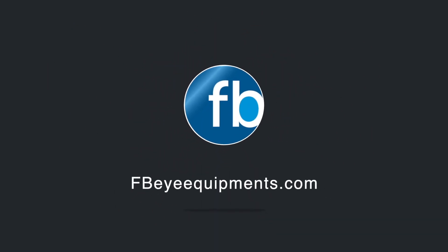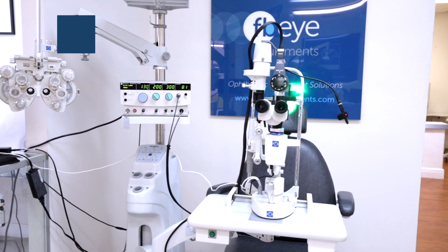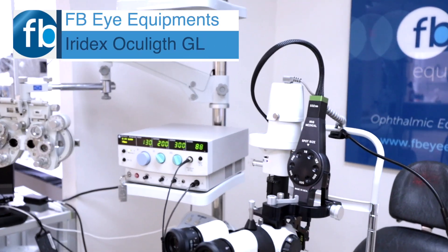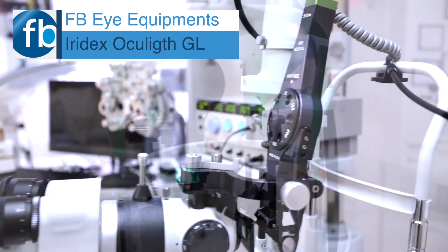FBI Equipments presents the Eridex Oculite GL. This member of the Eridex photocoagulator family is the definition of control, precision, and convenience.